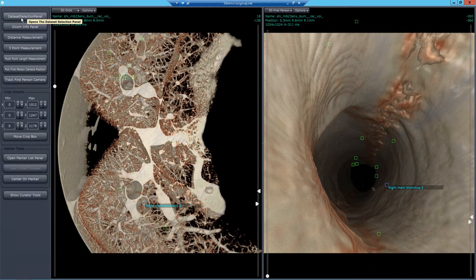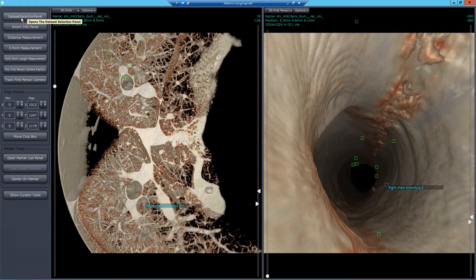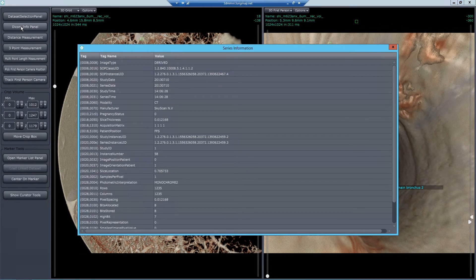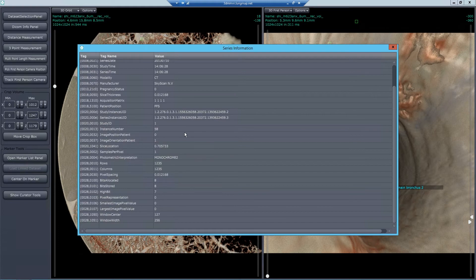On the left we have the data selection panel, the same panel that comes up when you first open the app, and it lists all the data sets that are available. You click on one and go to it. The data sets are all DICOM format, so the DICOM info panel gives you the detailed information about the DICOM.